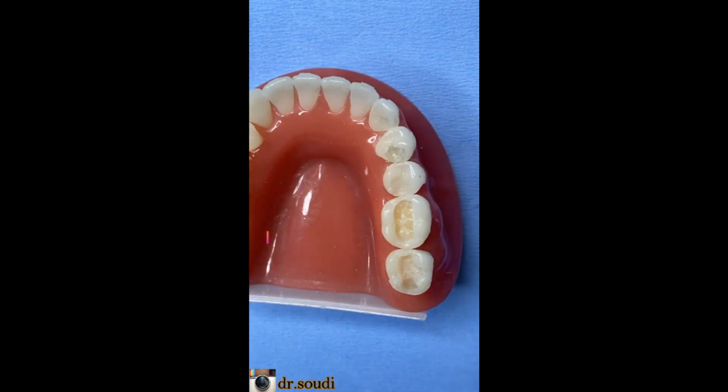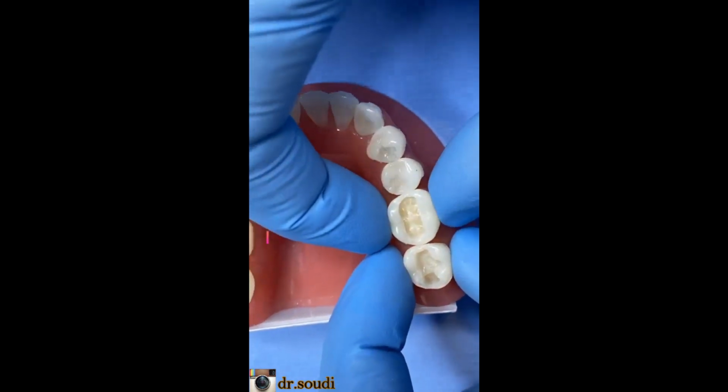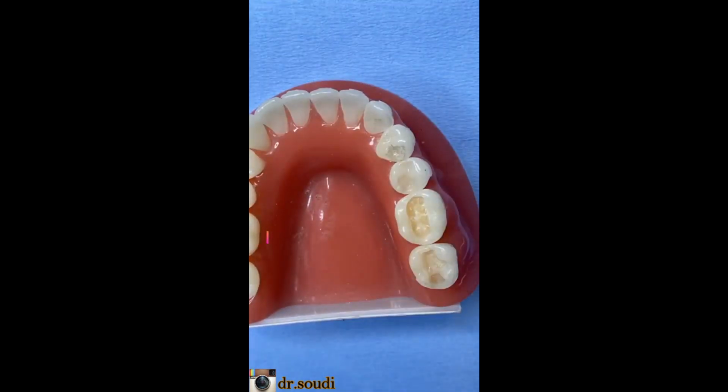Okay, now we have two choices, either to do single tooth isolation for this tooth only, or I will do quadrant isolation. I prefer always quadrant isolation if you have time. If you don't have time, like if you are doing access for an endo patient, or if you will remove the caries, you can use a single tooth isolation. I will show you how it will work.